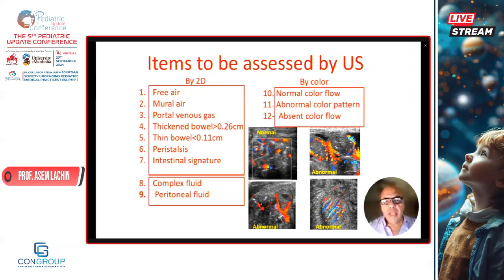Usually we accept from 3 to 9 different colors in one image. If it is more than this, that indicates some kind of hyperemia, and if it is less, it indicates some kind of gut ischemia. And there are some shapes here called zebra shape, and this is Y-shaped, and all of them are abnormal patterns of intestinal ultrasound color.